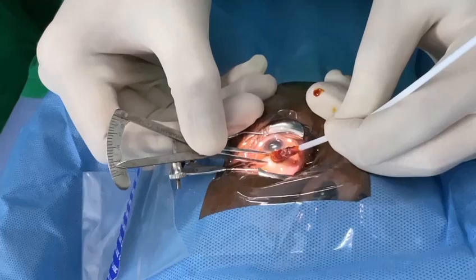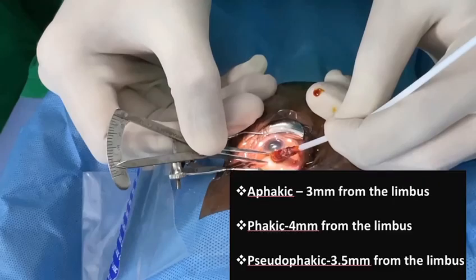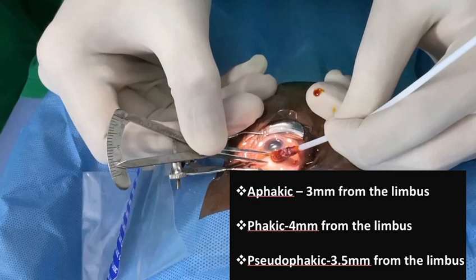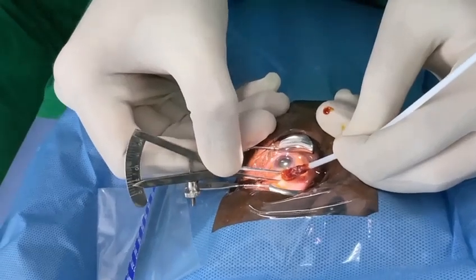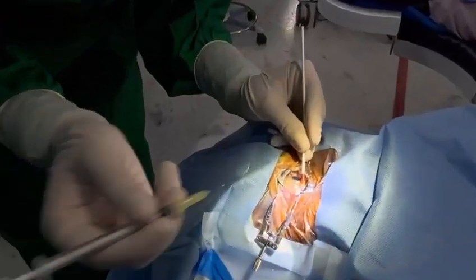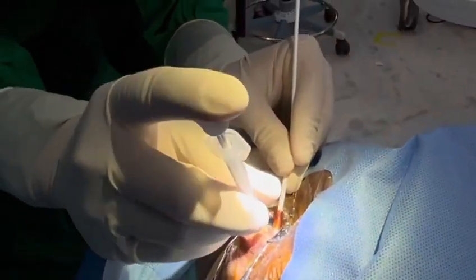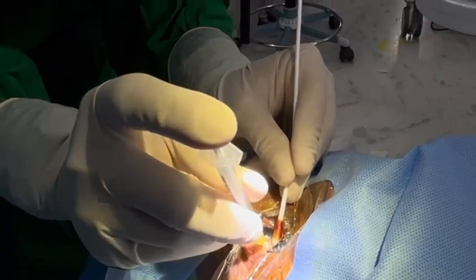Distance from the limbus is measured with the caliper in the infero-temporal quadrant: 3mm for aphacic patients, 4mm for phacic patients, and 3.5mm for pseudophacic patients. With a 30 gauge needle beveled up and the needle pointing towards the optic disc, the injection is given.